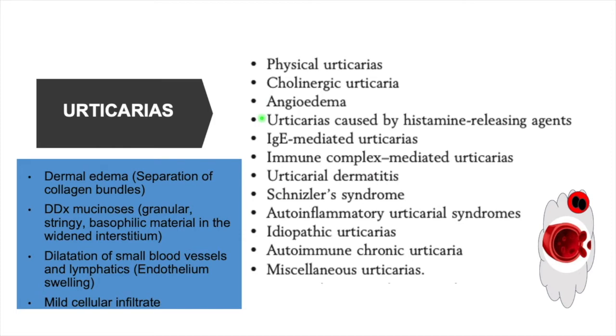So all related to basically allergy, IgE mediated urticarias, immune complex mediated urticarias, urticarial dermatitis, Schnitzler syndrome, autoinflammatory urticarial syndromes, idiopathic urticaria, autoimmune chronic urticaria, and miscellaneous. So all these different examples, but the same morphology. You will see edema, eosinophils, and low cellular component.